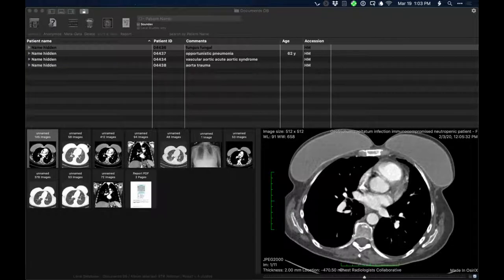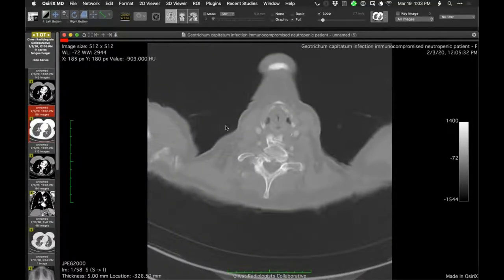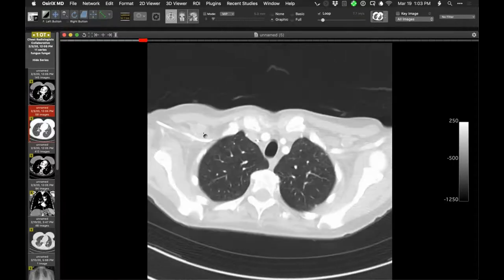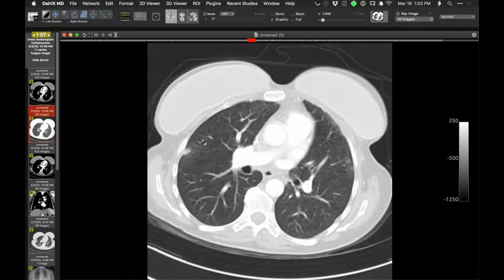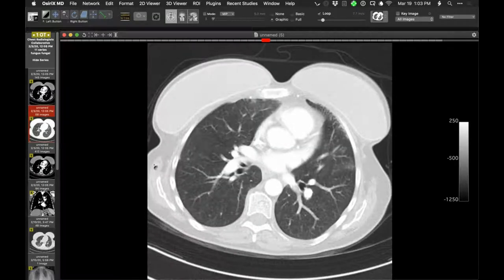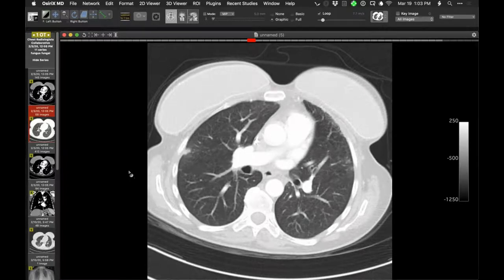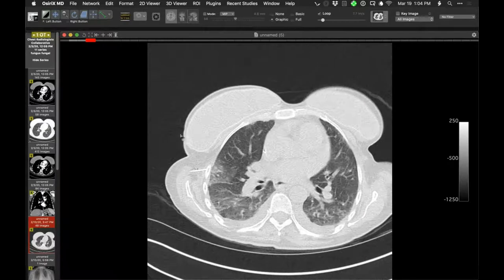All right, I'll start with this person. This is a person with an immunocompromised state being treated for, I think, breast cancer, but also that was remote, but a more acute abnormality, which I'll show you in a moment. I think it's a hematologic malignancy. This is a comparison from February, in which this nodule was at that time small, and over a period of 7 days, that became larger, conspicuously larger.